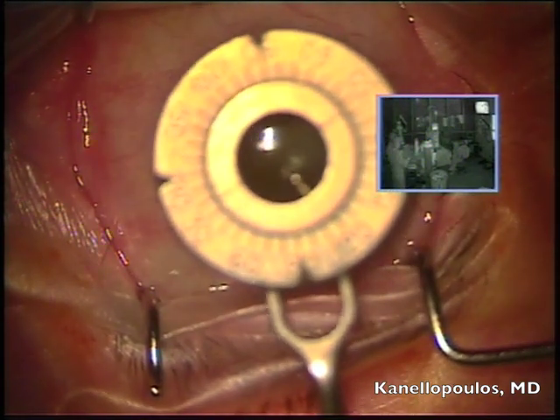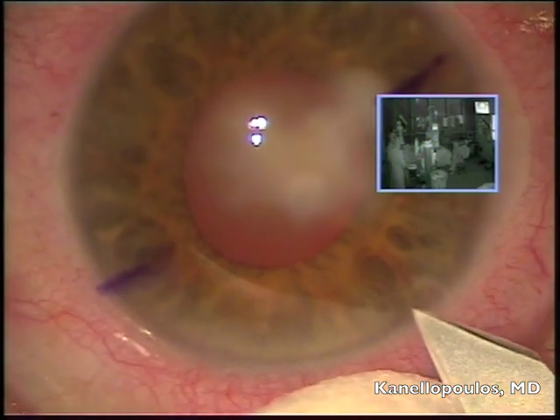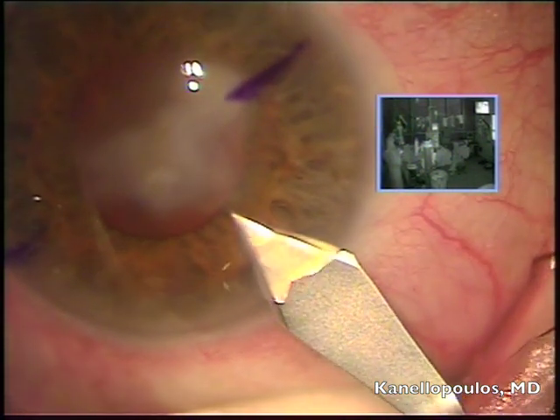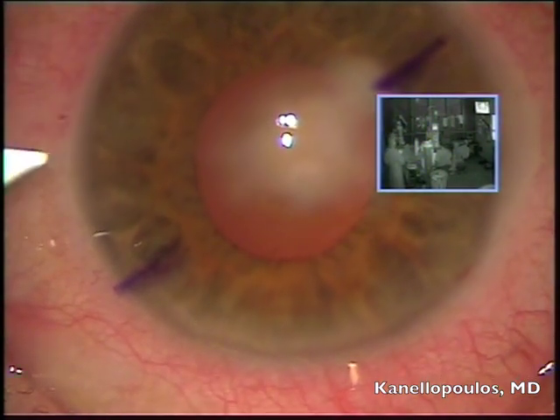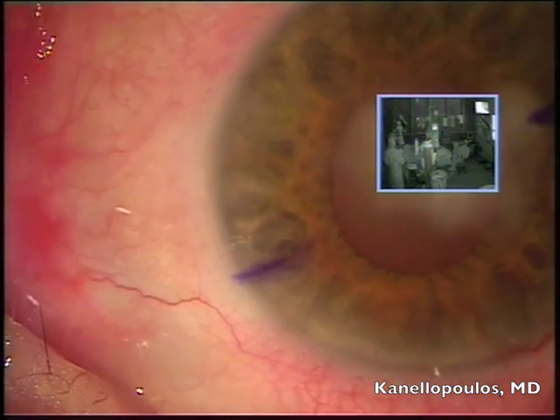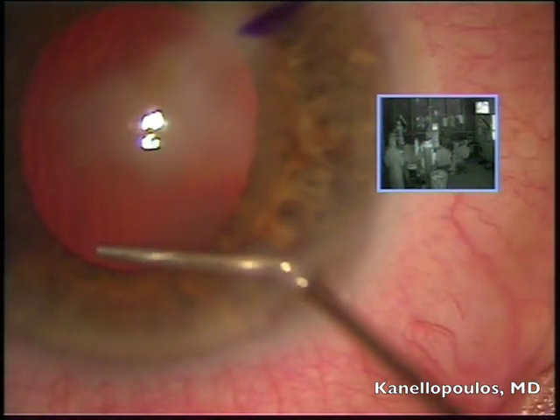So here, back to our patient, we're going to mark the 24 degrees on the cornea as seen here. We're using that 6 o'clock marker and the vessels at the 12 o'clock position. A 2.75 keratome, a beveled clear cornea incision. Pretty easy visualization, not a problem for the incisions. It'd be impossible to use a femto here, by the way, to perform a capsulotomy, and then using the same blade for a 1 millimeter paracentesis, using diluted epinephrine to attain a little bit more mydriasis.